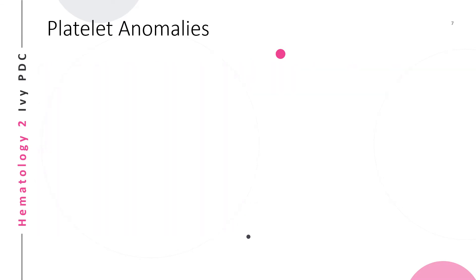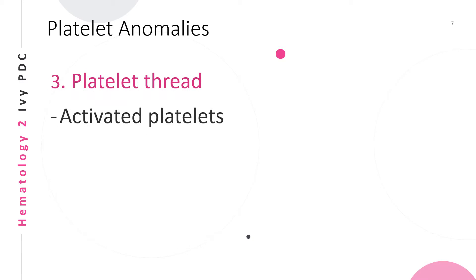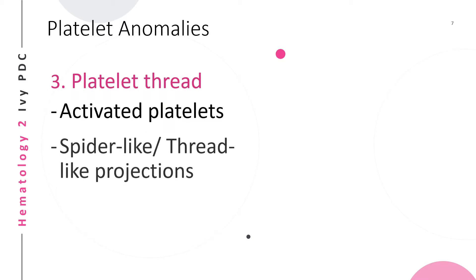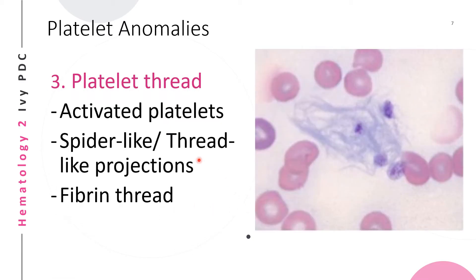The third platelet anomaly is the platelet thread. This occurs when platelets have been activated before the preparation of a blood smear. They are characterized by spider-like or thread-like projections — these are fibrin threads that the platelets have formed for coagulation or clotting.